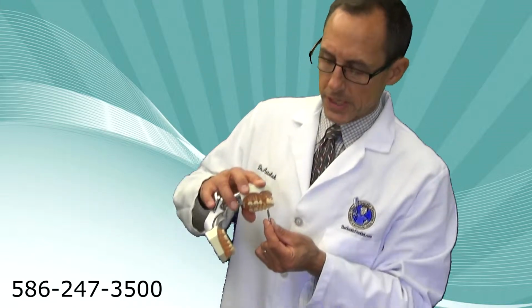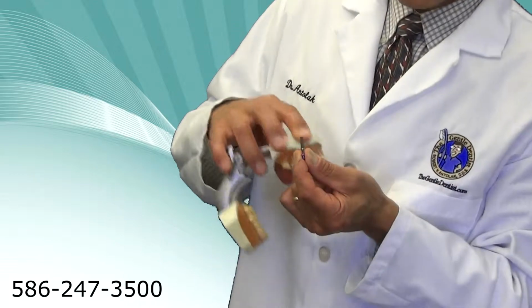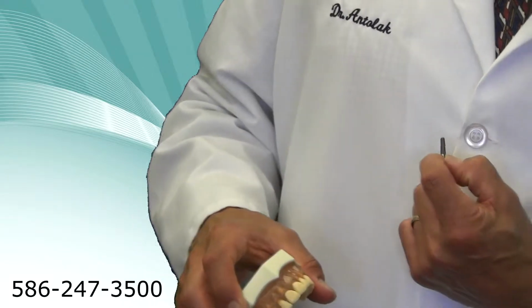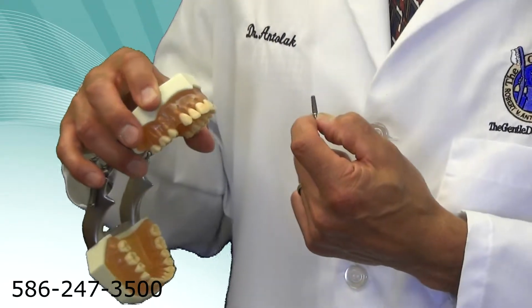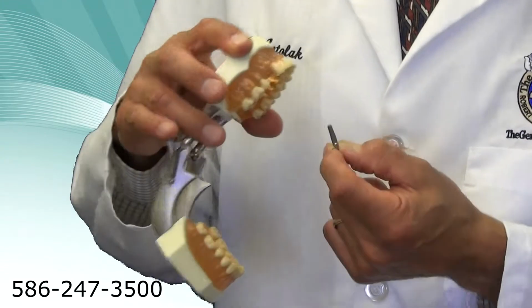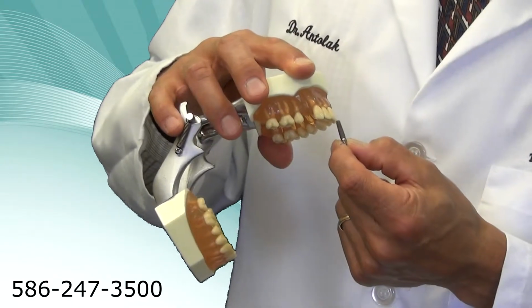And so we have our dental implants. In this patient's case, a tooth is missing, then we can put in an implant. It's made out of titanium, and you can see this is the implant right here that would go into the jawbone. When it gets put in the jawbone, the bone actually heals around it. It takes between 3 to 4 months for that bone to heal around it, and then it's strong enough to support a tooth.